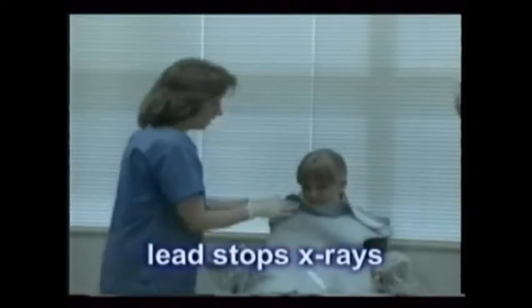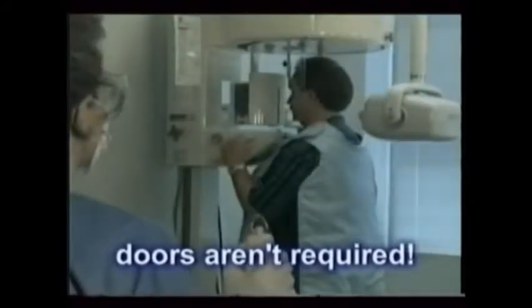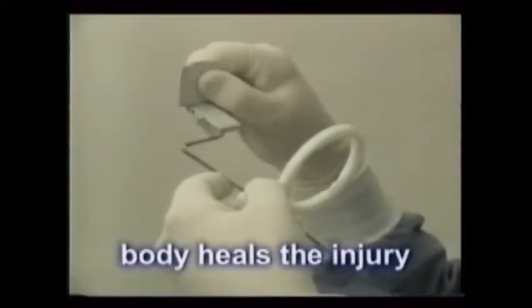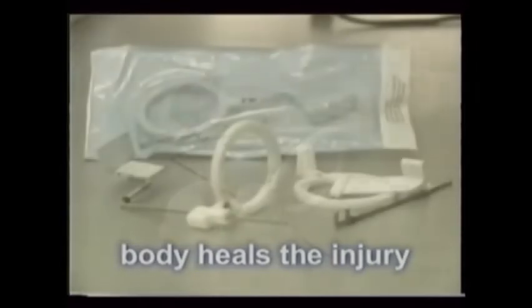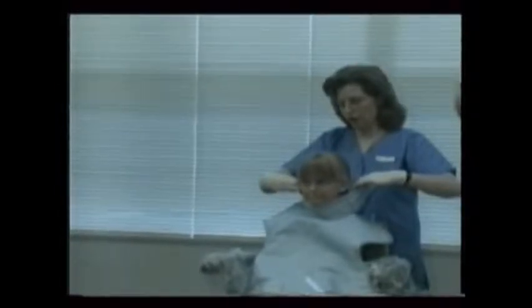About the only thing that absolutely stops X-rays is lead. One testament to the low levels of X-ray that we use in dentistry is that the walls and the doors of our rooms need not be lead-lined. In fact, the doors are not even required. You can share these facts with apprehensive patients to help allay their fears. The energy is absorbed by the body, and it causes some degree of injury with every exposure. The body, though, through many of its wonderful processes, is able to heal the injury. It's our duty to minimize the X-rays through proper technique, using film holders, fast films, lead aprons, and when the benefits outweigh the risks, X-ray use, in spite of its drawbacks, is perfectly acceptable.